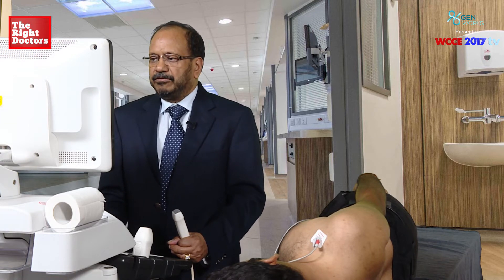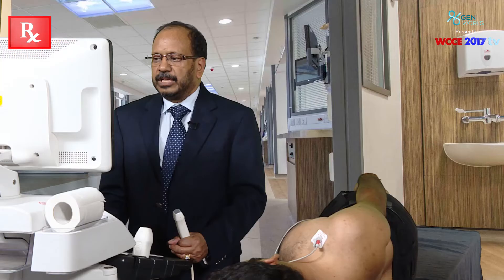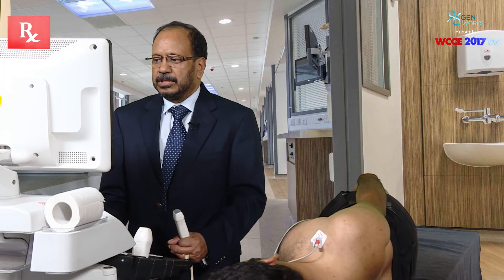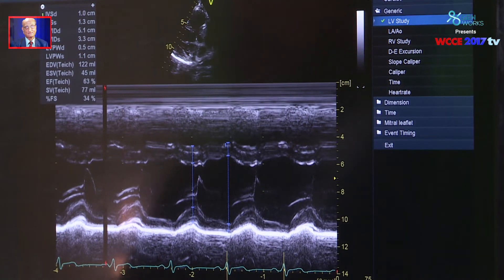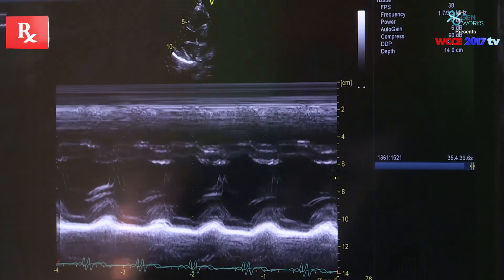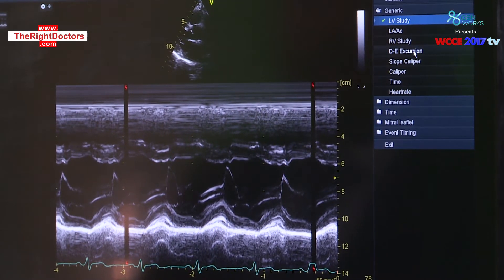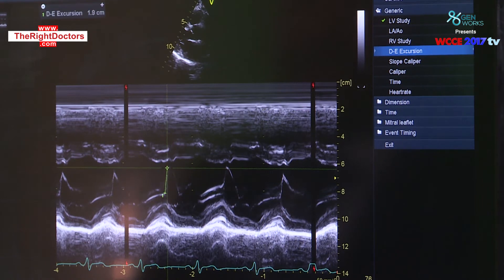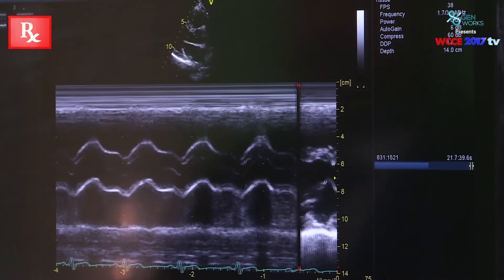Here is the left ventricular interventricular septum during diastole and posterior wall during diastole. Similarly, we take the septum during systole and posterior wall during systole. Most importantly, we are able to look at the IVS during diastole and systole, and similarly the LV posterior wall during diastole and systole. We store these measurements and then scroll back to evaluate M-mode findings including DE excursion and subsequently EF slope.